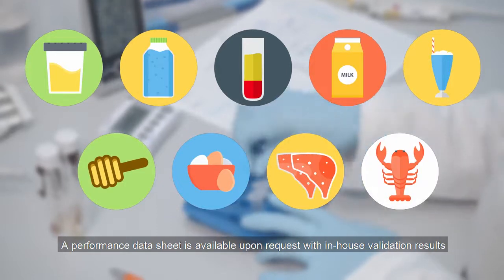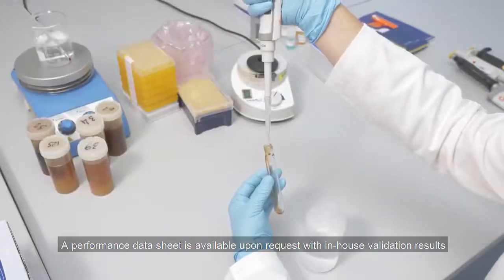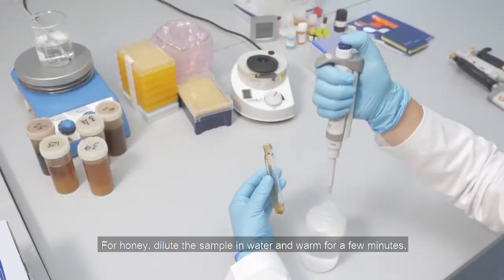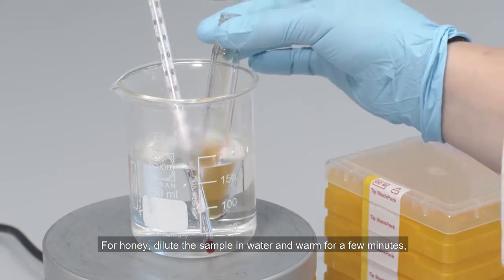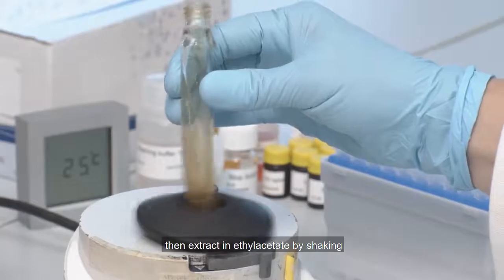For honey, dilute the sample in water and warm for a few minutes, then extract in ethyl acetate by shaking.